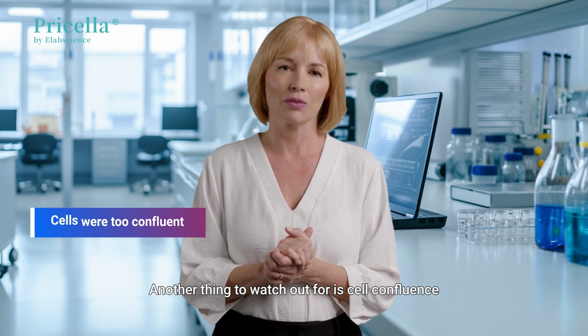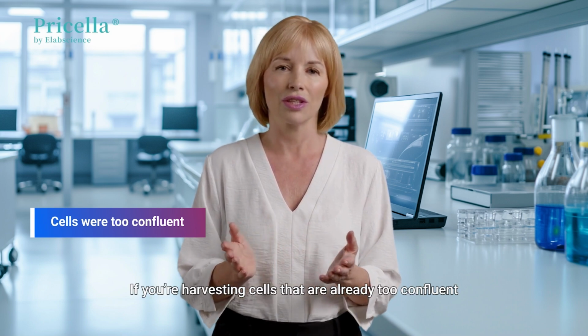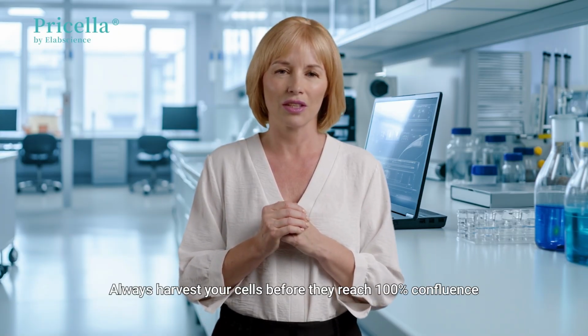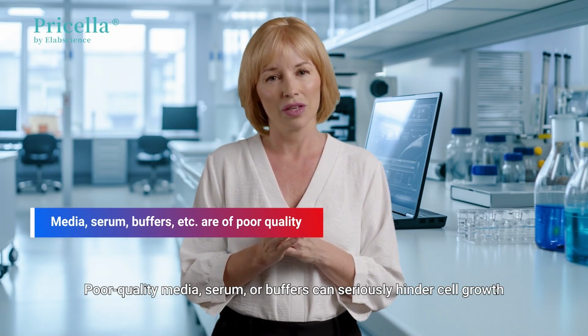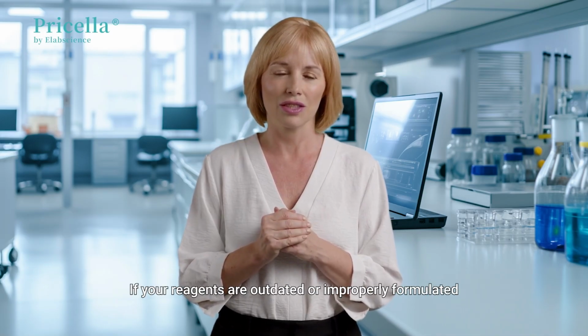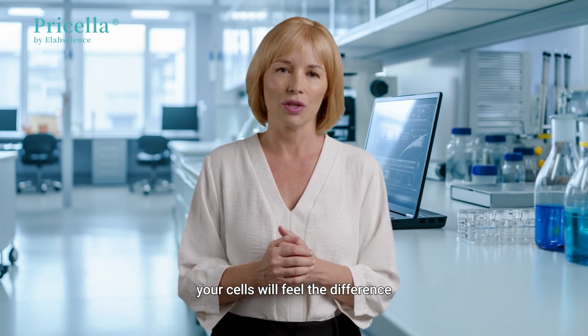Another thing to watch out for is cell confluence. If you're harvesting cells that are already too confluent, they'll have slower growth. Always harvest your cells before they reach 100% confluence. Also, don't forget about your media. Poor quality media, serum, or buffers can seriously hinder cell growth. If your reagents are outdated or improperly formulated, your cells will feel the difference.